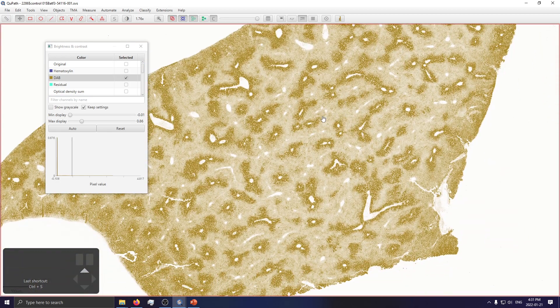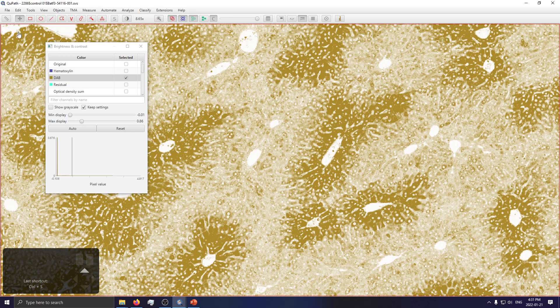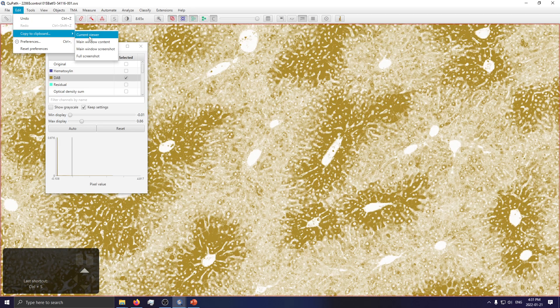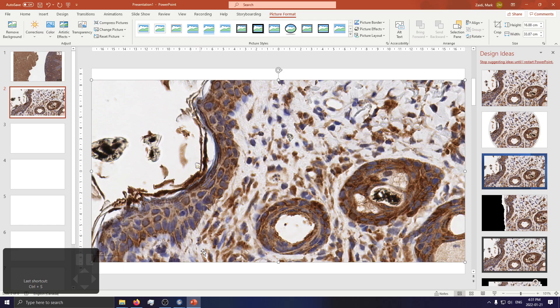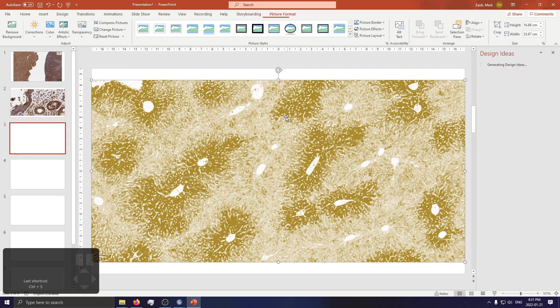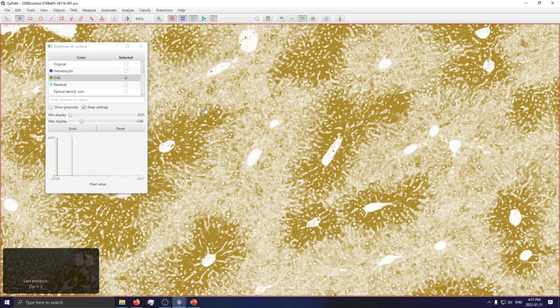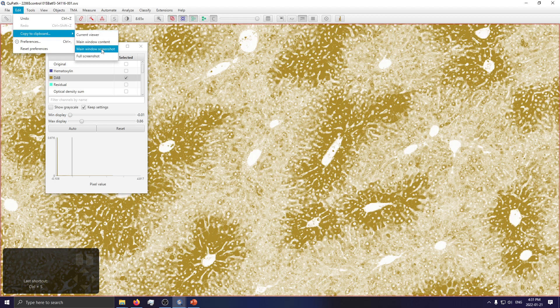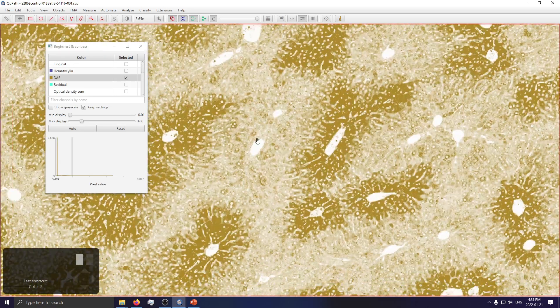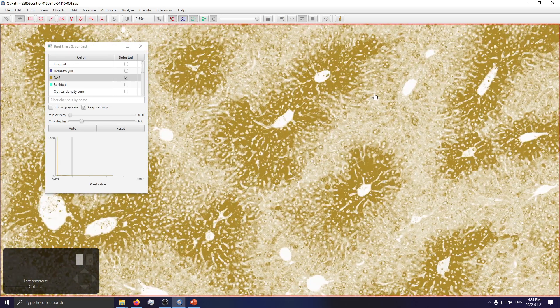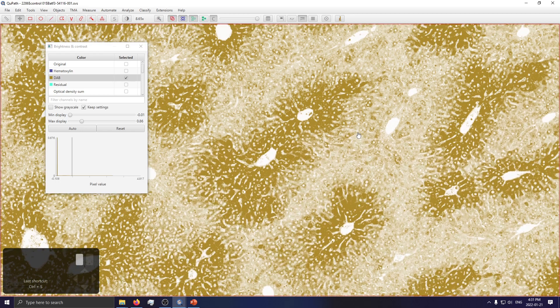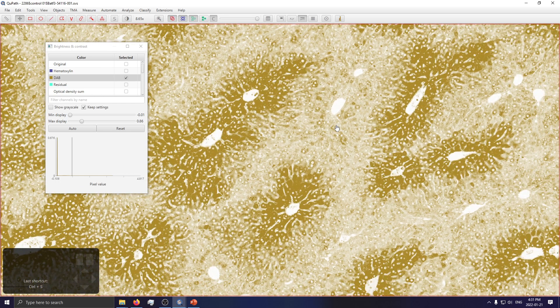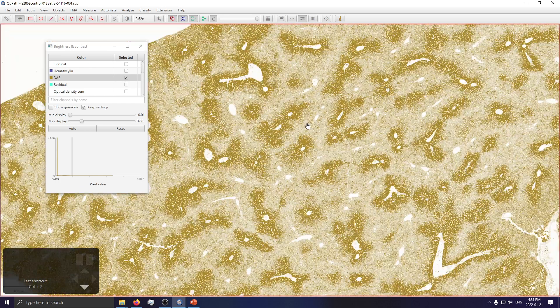To take a screenshot, same as before — Current Viewer. Or maybe you'd want to do the main window content full screenshot. It's up to you — there's no wrong answer. Nothing you do here will ever change the underlying data of your images, so there's no way you can modify your images, even by accident.